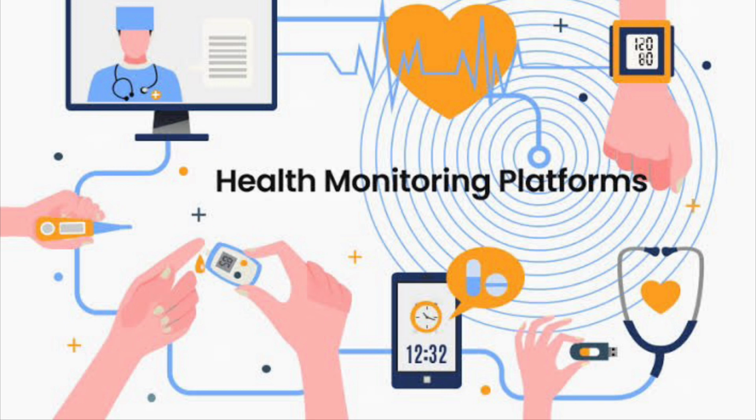And second, the next step is the care coordination software to help you manage the continuous vital signs monitoring. Technology-wise, it might be easy to generate continuous data. But the problem is what we do with the data. How are we going to monitor the data? Is the data going to be remotely monitored by some other office? What is the security of this data? Is it going to be in a domain which is not secure, because it's healthcare data? And what is the professionalism of the people who are looking into this data?